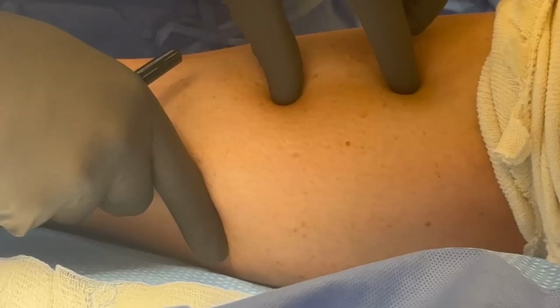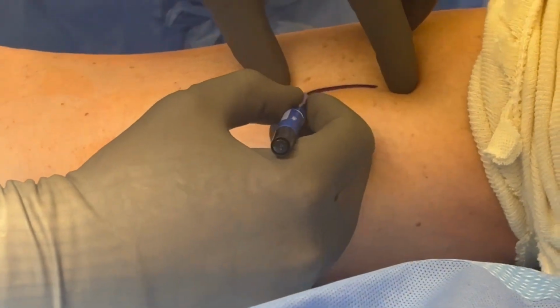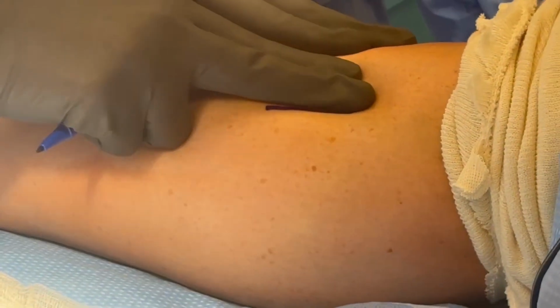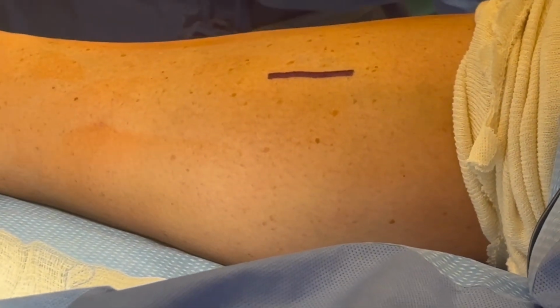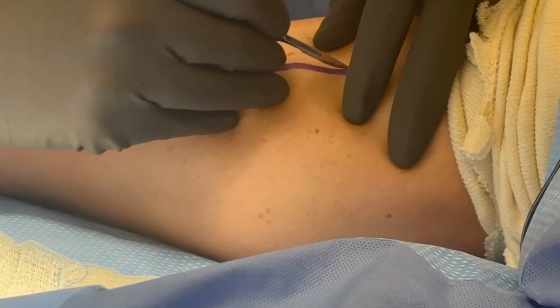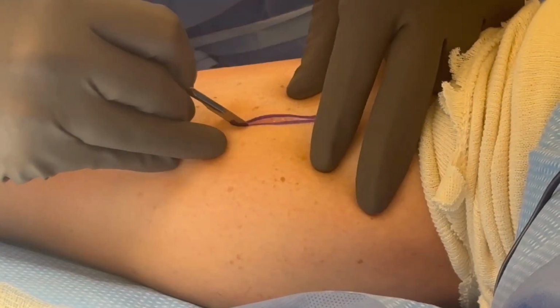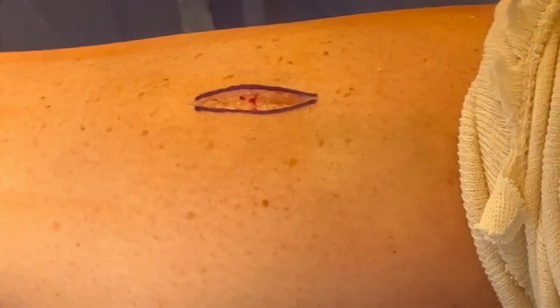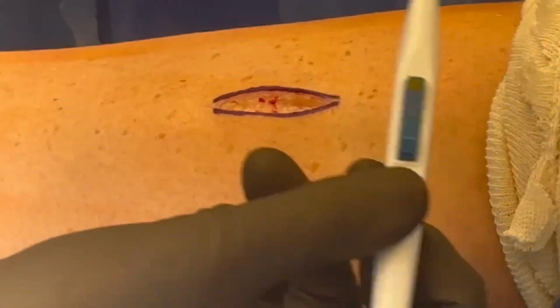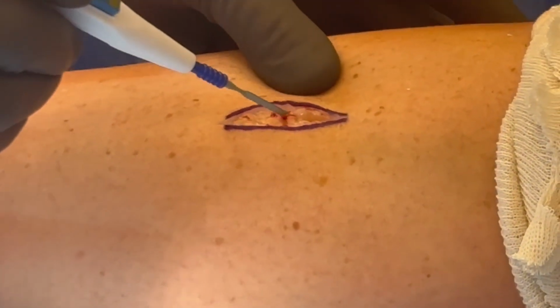I like to draw out my skin incision. I tend to make the incision about 2 finger breadths below the tibia and at the widest part of the gastroc soleal complex, in the meaty part of the calf, about 4 centimeters in length and parallel to the tibia. I'm showing the landmarks now.